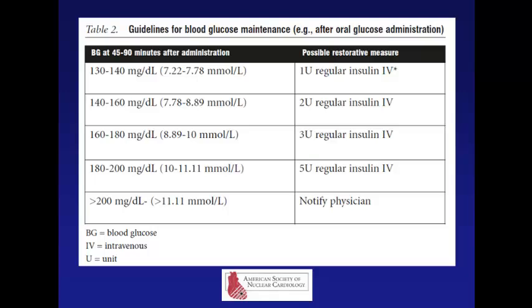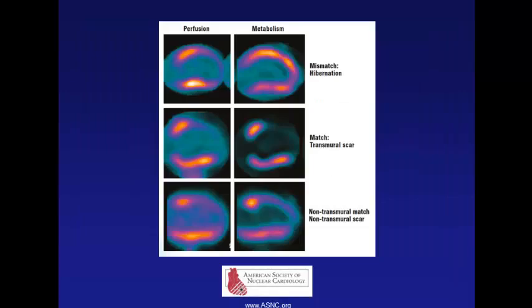But in reality, you want to have a lot of insulin, which improves your uptake of FDG. That's why you give glucose, because you want to have insulin high. Even in a healthy volunteer, in a healthy patient, with regard to diabetes, glucose goes up, and then insulin goes up, and then your FDG is being taken up. So this is what you can find.